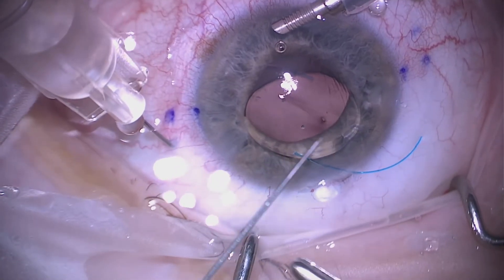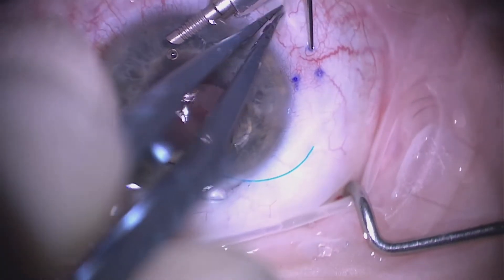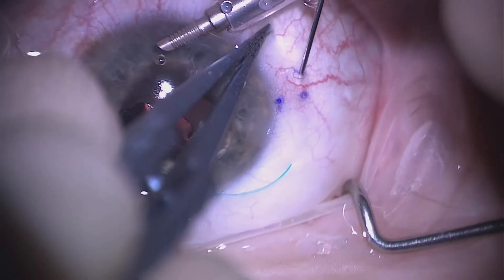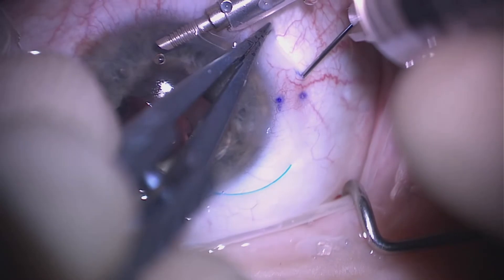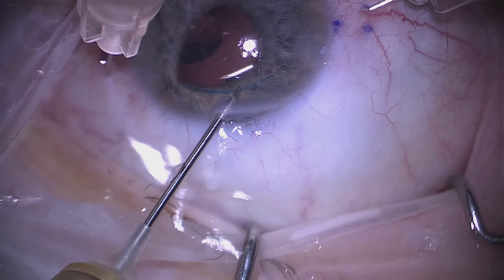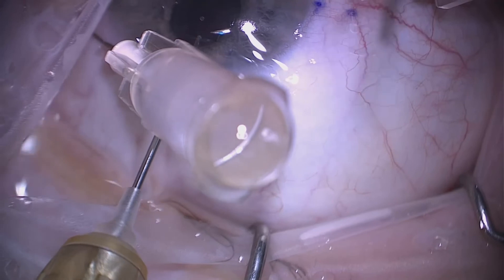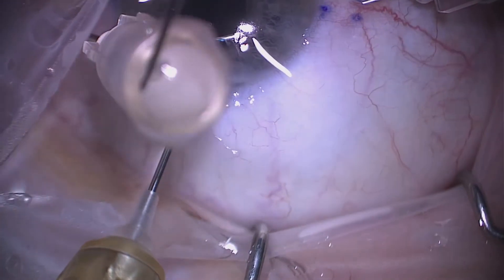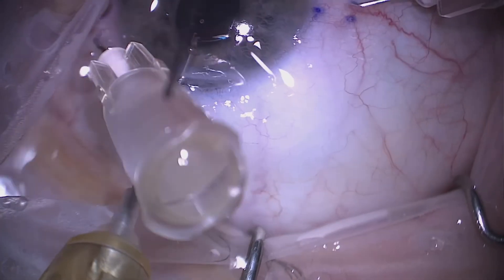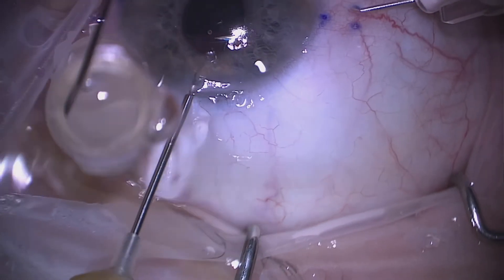We bend the second needle with the bevel facing out, again making a two-millimeter initial track, then dive 90 degrees perpendicular to the sclera into the anterior chamber. Once again, we maintain composure, very gently feeding the trailing haptic into the needle and ensuring that at least half the haptic is in the needle.